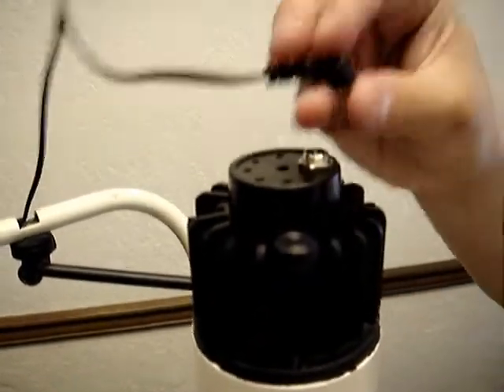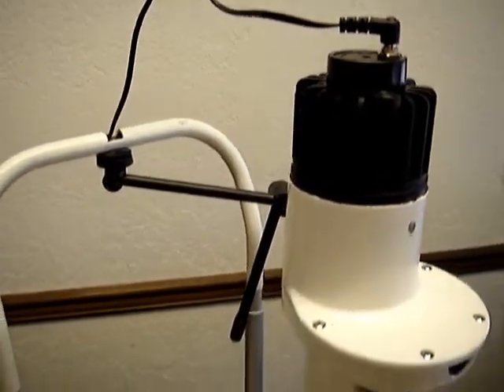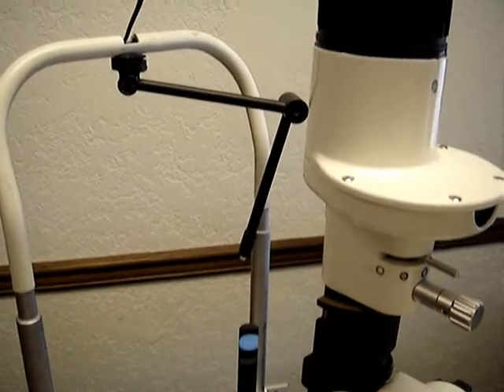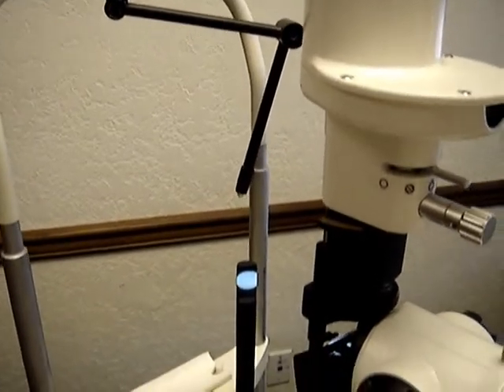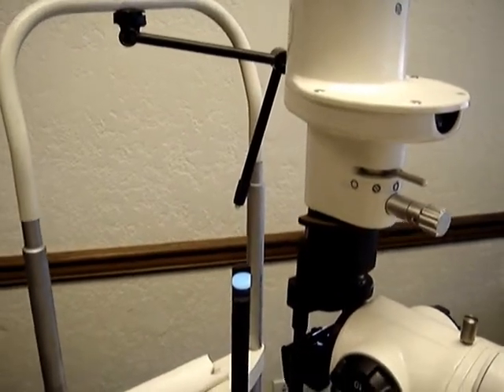Next, you are going to plug in the DC adapter. And then, you are going to turn on the switch. And that is how you replace the solid-state LED light bulb for the C-Max 800 series slit lamp.